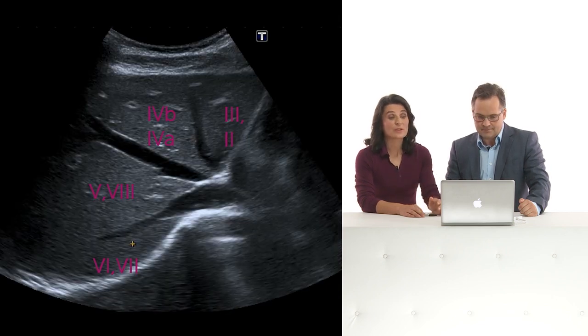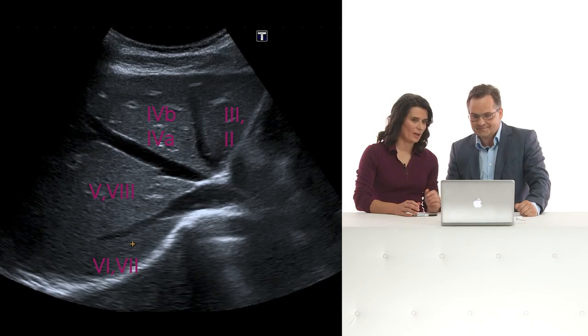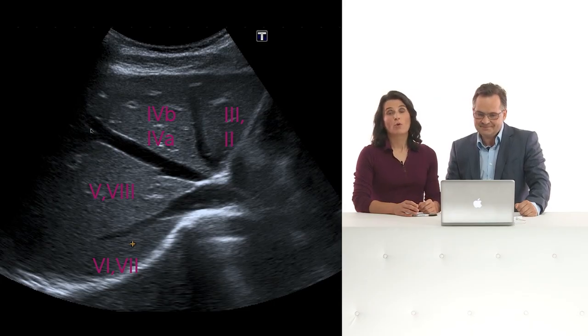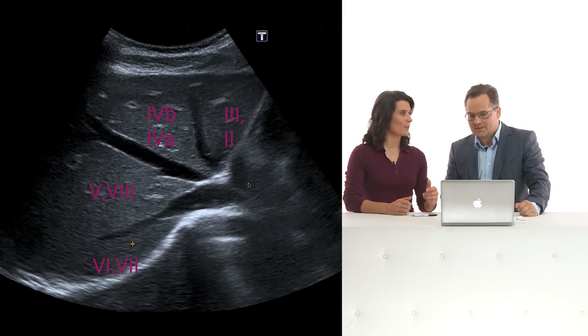So now we can count the segments of the left liver lobe first. We got segment 2 and 3, segment 4A and B, and additionally segment 1, which is quite near the IVC. And the segments 2 and 3 are situated left of the left liver vein. So near to the heart over here. Segment 4, 4A and B, is situated between the middle and the left hepatic vein. And segment 1 is situated adjacent to the IVC. But we can't see it in this picture.